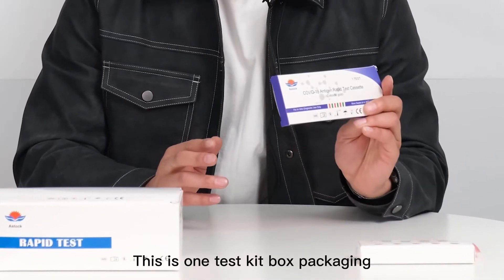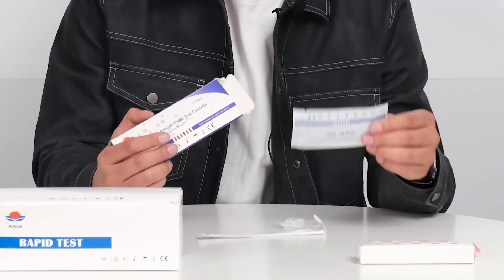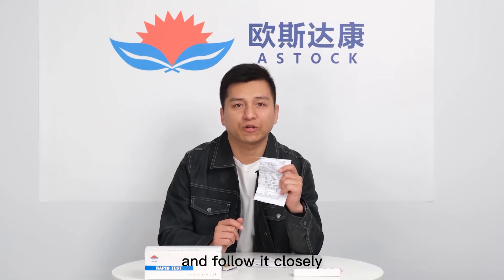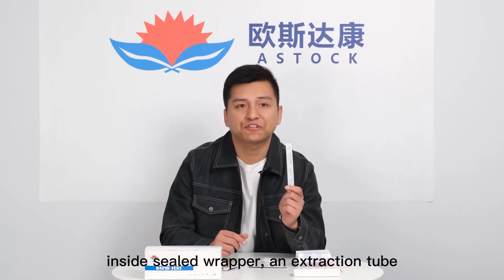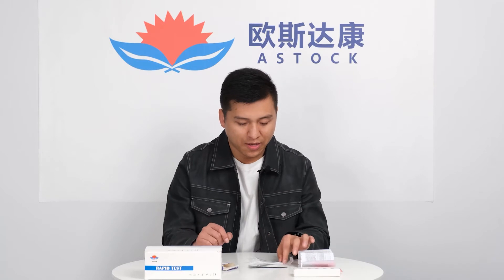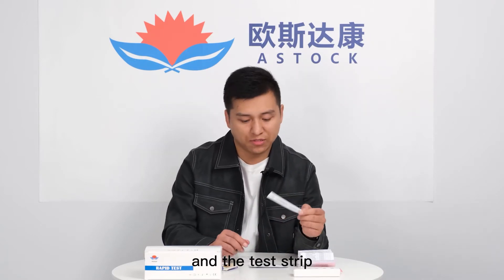This is one test kit box packaging. Now let me open it. The instruction leaflet is inside. Please make sure you read the instruction carefully and follow it closely before taking the test. Inside you'll find a swab in a sealed wrapper, an extraction tube, an extraction tube holder, extraction buffer sachets, the test strip, and the waste bag.